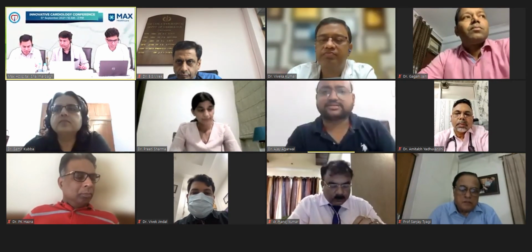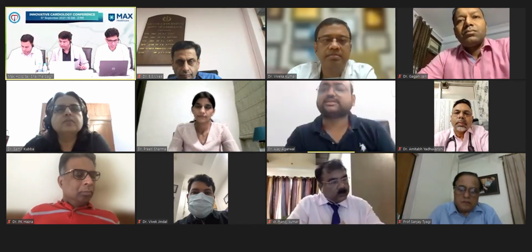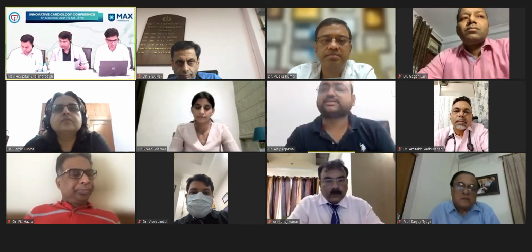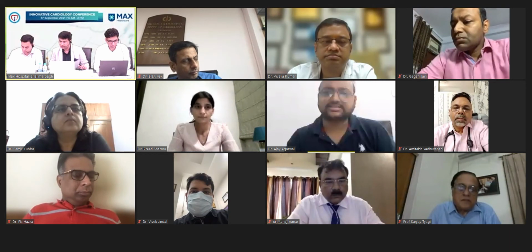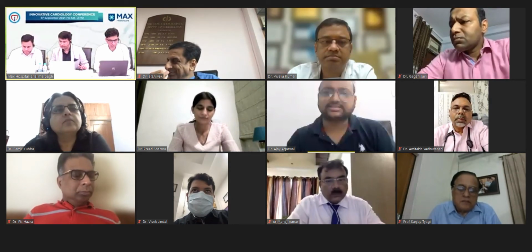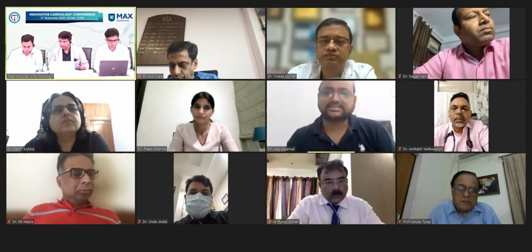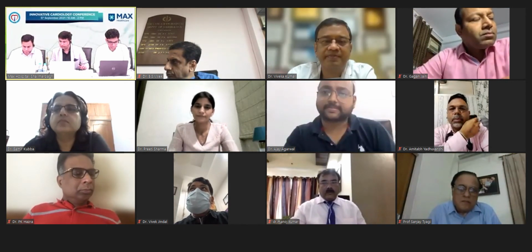Yes, of course. As Dr. Preeti has said, stent failure, stent restenosis, is the prime indication for doing the OCT. I want to ask a question: what are the confidence markers in acute MI, when you do thrombosuction and see the lesion is not significant, what criteria should be followed for putting the patient on medications instead of putting a stent? So the answer is, look at the vessel wall.